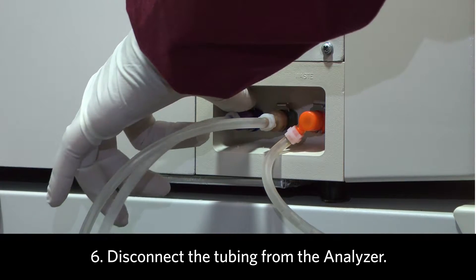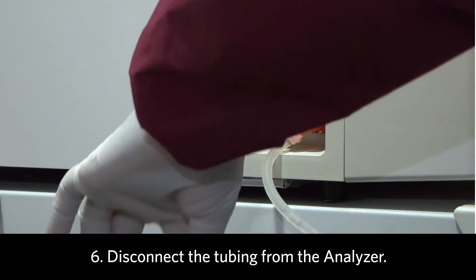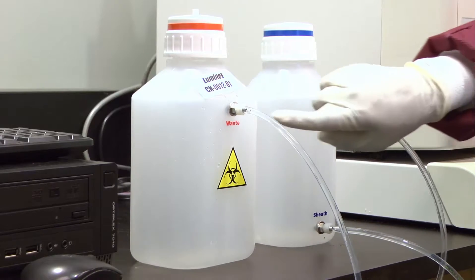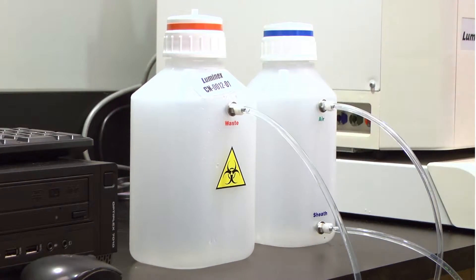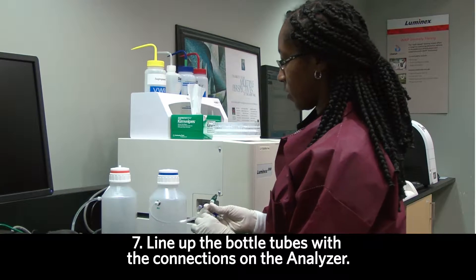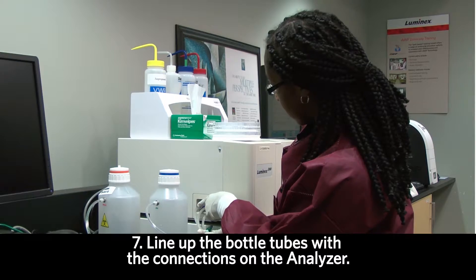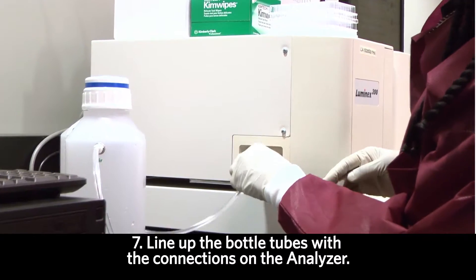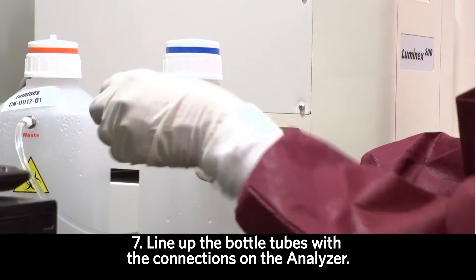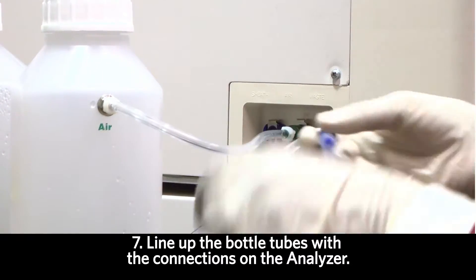Next, disconnect the tubing from the analyzer. There's a sheath waste bottle and a sheath bottle with the air connector and the sheath connector. Make sure to line up the tubing from the bottles to the wording and the connections on the analyzer. Make sure to add water, waste, air, and sheath.